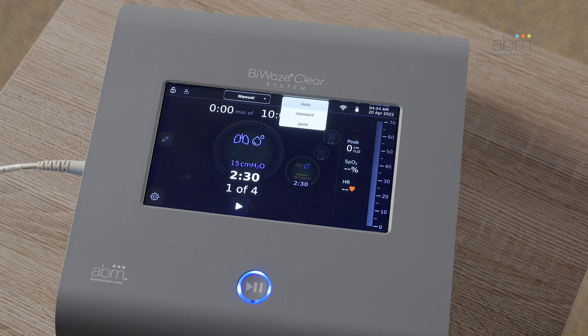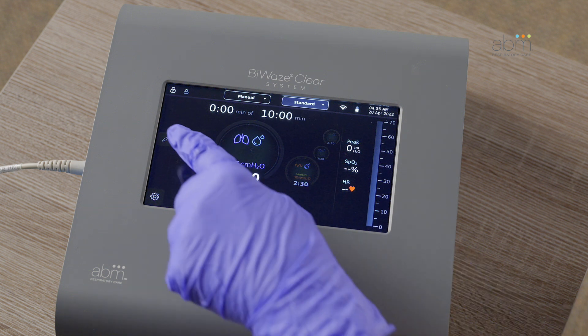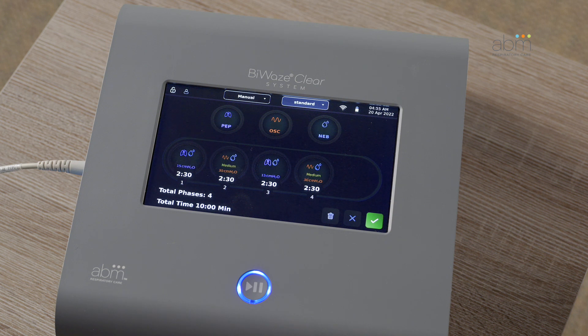To program Auto Mode Therapy, press Auto Mode on the top of the screen. Press the pencil button on the left of the screen to program the prescribed therapy.